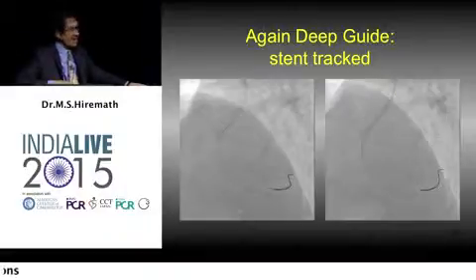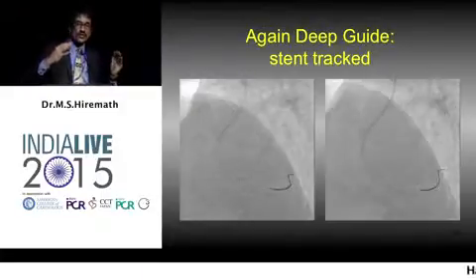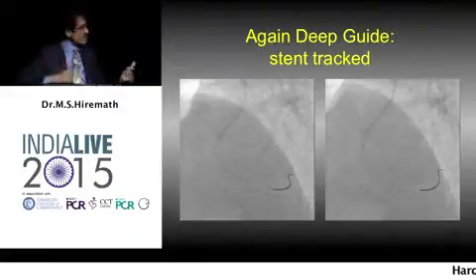Now, here again, we had to change the guide catheter. There are certain brands of catheter which are not so flexible, but certain catheters which are extremely flexible.